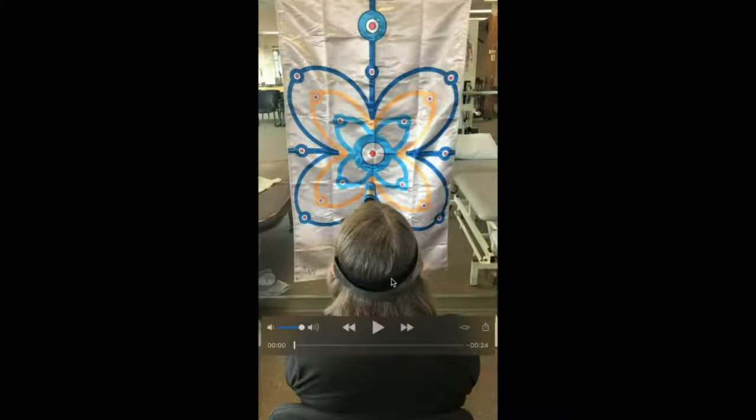She has the medium to large size band on her head, and she has the perpendicular mount with the green laser on. Now, for initial testing, I have them look at the center target here. So that's where their fixation is going to be for the VOR. I have the laser up here. You can kind of see a little red, the green dot up here. And that's going to give me a representation going back and forth of what her VOR quality is, the distance side to side, and if there's anything else I need to kind of check out there.